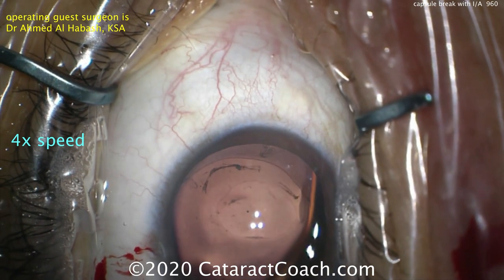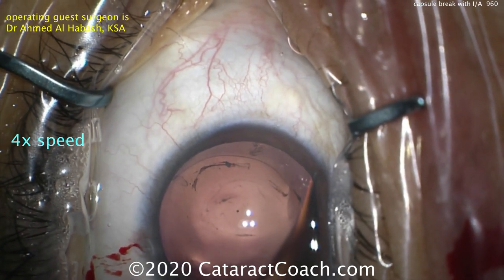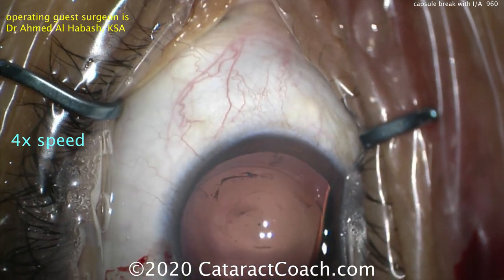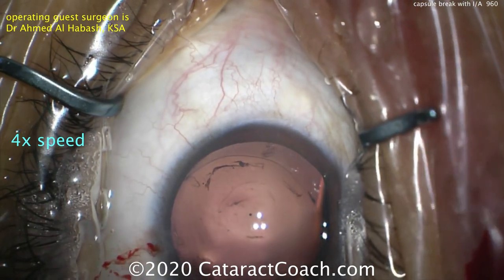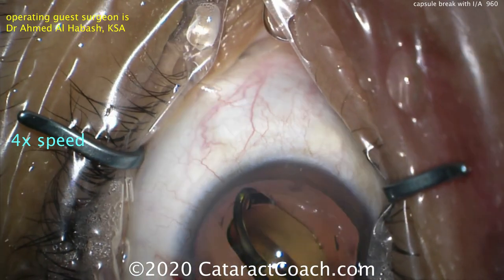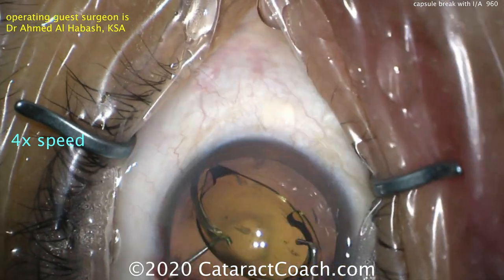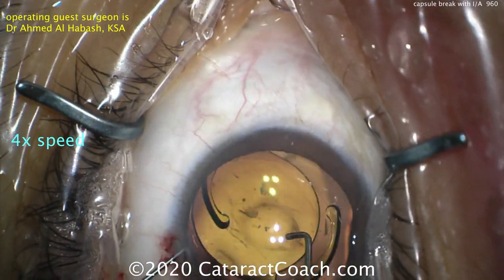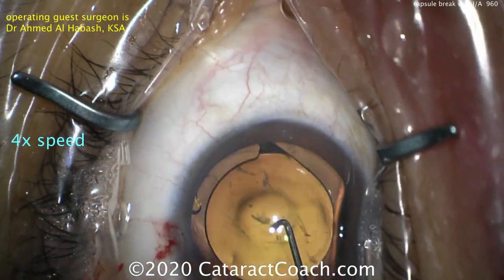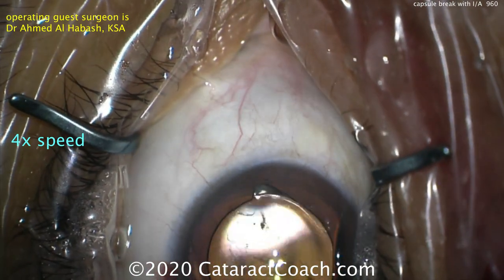The IOL can then be placed inside the capsular bag. Options include a single-piece acrylic lens in the bag, or a three-piece lens which gives more options for placement — sometimes with haptics in the sulcus and optic captured. Here, with a strong posterior capsulorexis, this single-piece acrylic lens can go in the capsular bag and will be perfectly fine. The posterior capsular opening is now covered by the optic, which is very helpful.